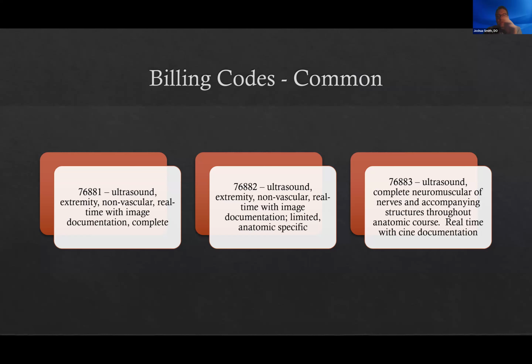But you just want to document it as you're doing it, and then record the videos too and save the videos. Most ultrasound machines, standalone or integrated, make it pretty easy to record the videos as well. Different ones have different lengths, so depending on how long the video recording is, you might have a couple of videos to track it all the way. Some of the standalone machines record for a couple of minutes, so it's easy to take your time and get a nice video of you tracking it through its whole course.